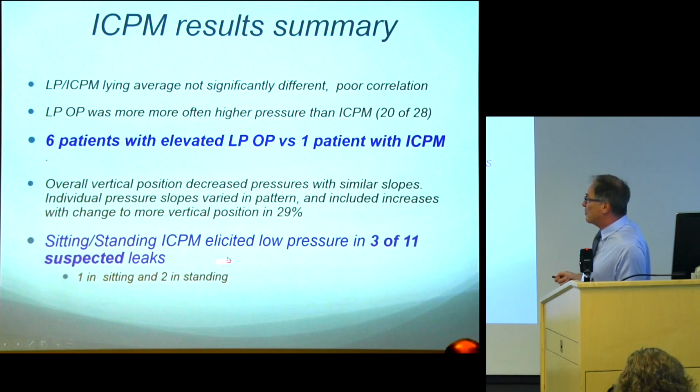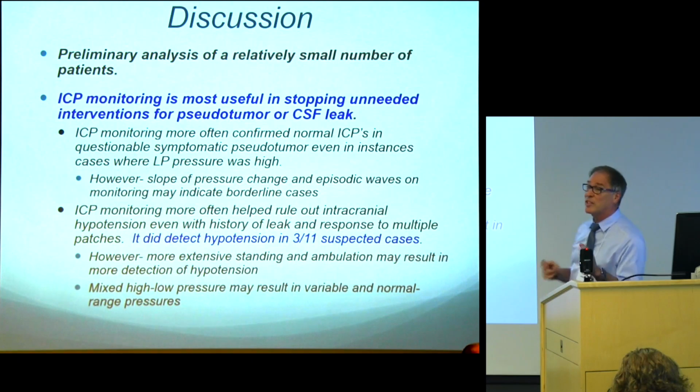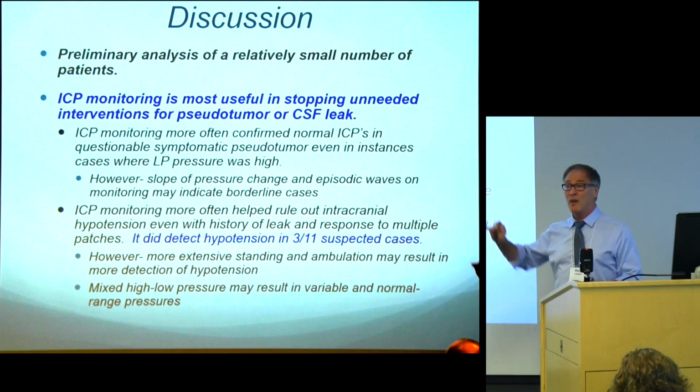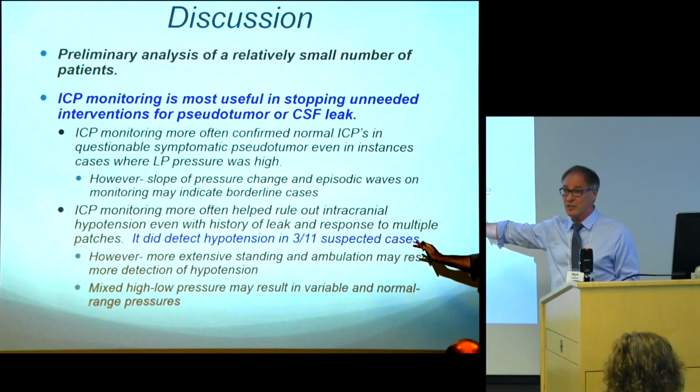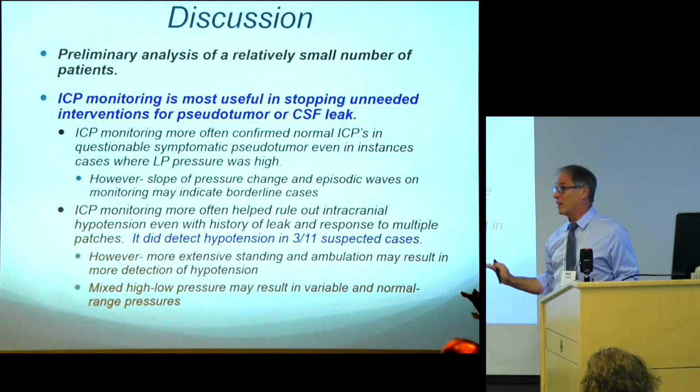I think the ICP monitoring gives us the opportunity to do various provocative tests, but also to do the different positions in a systematic way. And I think we will be finding more patients who have low pressures that are only revealed with the standing position. So ICP monitoring is most useful in stopping unneeded interventions for pseudotumor. Most of the time we did this operation, we found out that, I know you've had 10 patches and you think you have low pressure when you stand up, but your pressure is fine.